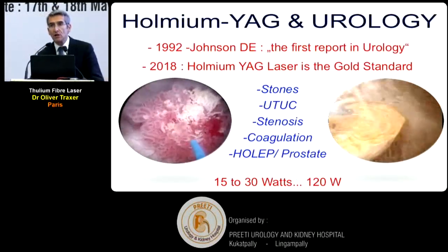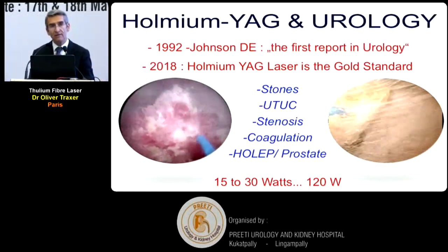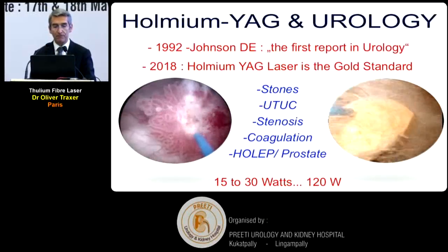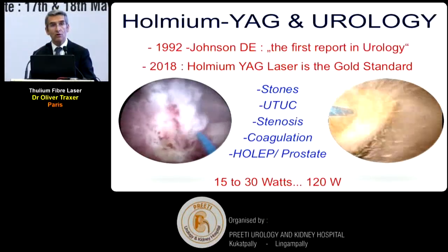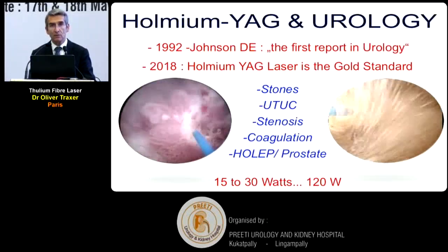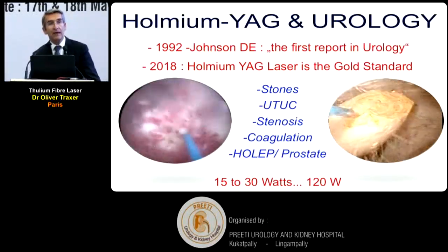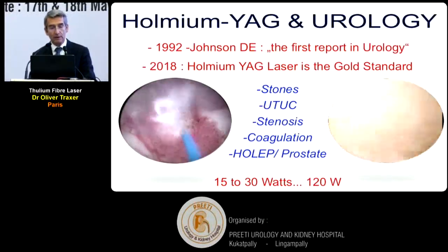Before we discuss thulium fiber, I would like to come back a little bit with holmium, because you need to understand this holmium technology before we move to the thulium fiber. First, I would like to say that Holmium-YAG, as you know, is the gold standard actually for the upper tract. We can treat any kind of stones. There's no specific resistance. We can treat urothelial tumors, stenosis, we can coagulate, and we can even treat prostate if we are using a high-power system.